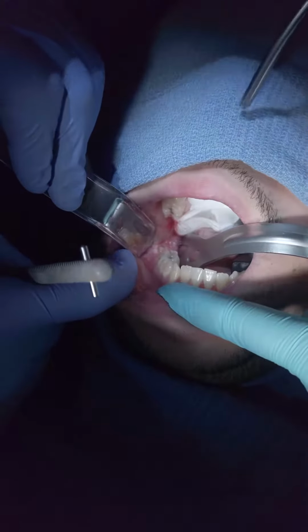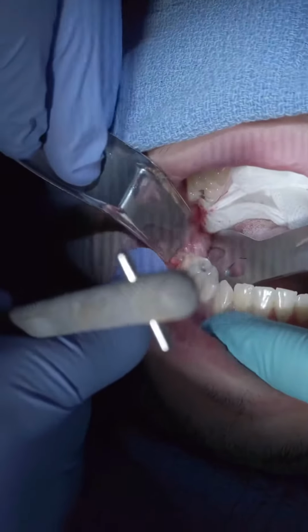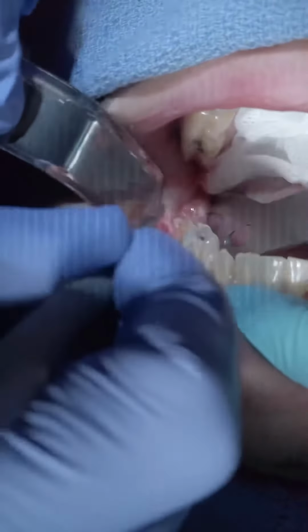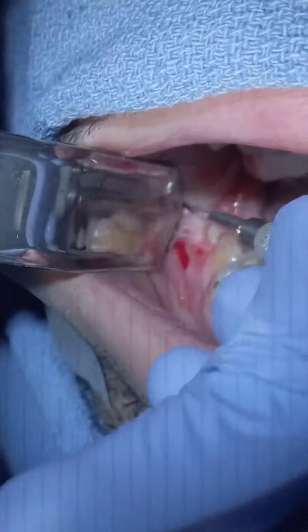So step number one when taking this tooth out is we've got to get a good flap design here. You see this distal buccal line angle of that second molar? We're going to use that as a reference point. So we're going to come over here and do a little buccal hockey stick incision.